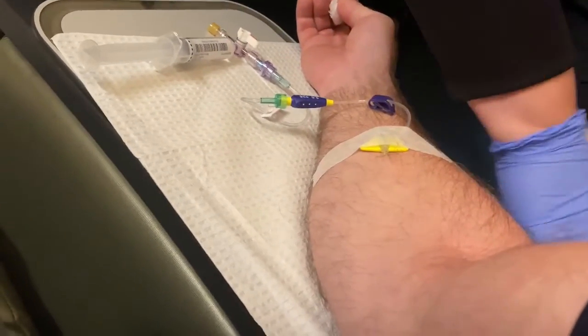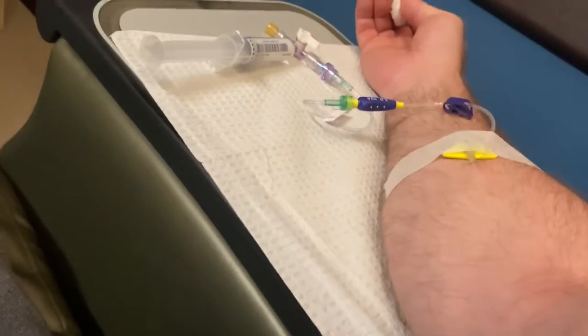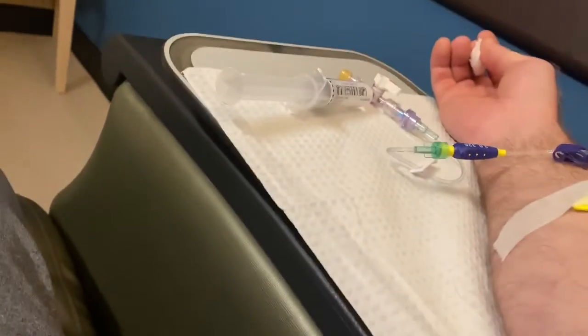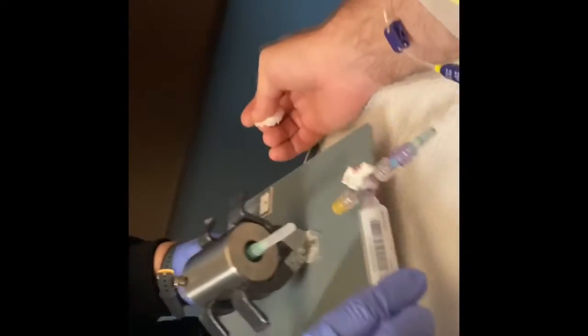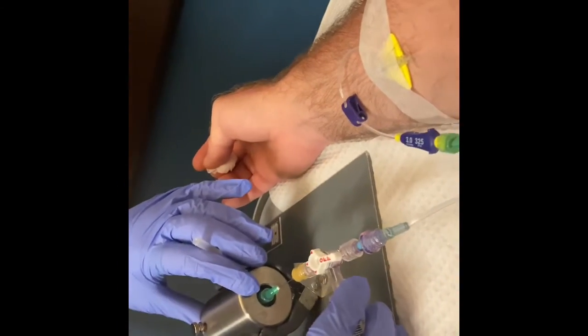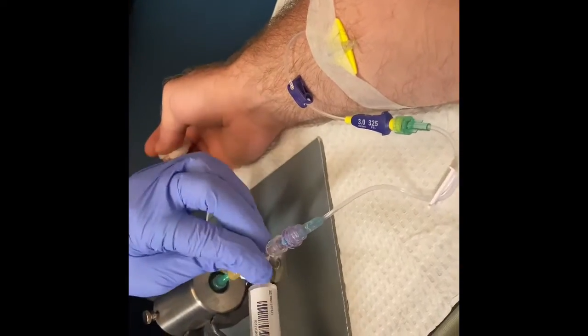Awesome. And you have to have special training for this, right? Yes, you have to be a nuke med tech. Nuclear med tech, that sounds so cool. I forgot about that. It is totally cool. You let me know at any time if it starts to burn, okay? Sure.